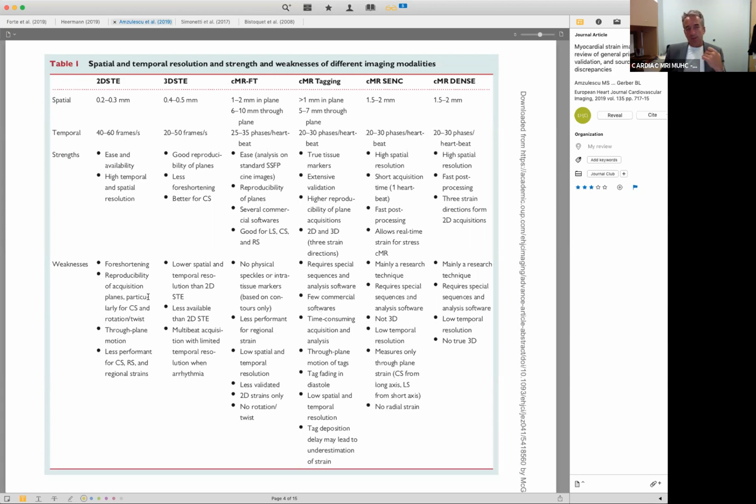However, circumferential strain imaging is important because it mainly gives the rotational motion that is provided by the inner layer, the subendocardial layer, which is the most important when it comes to coronary artery disease. So that's why circumferential strain and longitudinal strain are more important than others. The longitudinal strain is more a marker for the stiffness of the ventricle in general, so that's why it's particularly altered in amyloid disease and in all hypertrophic diseases. Whereas circumferential strain is probably the best when it comes to assessing inducible wall motion abnormalities during stress, for example.